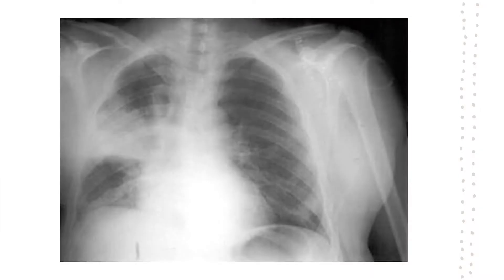This X-ray shows the findings you expect in a patient with right upper lobe consolidation. In the chest X-ray, which is a 2-dimensional image, the middle lobe is between the anterior margin of the 4th rib and the anterior margin of the 6th rib. So the middle lobe is located in that region, and all the remaining area you see is predominantly the upper lobe — this entire area is the upper lobe.